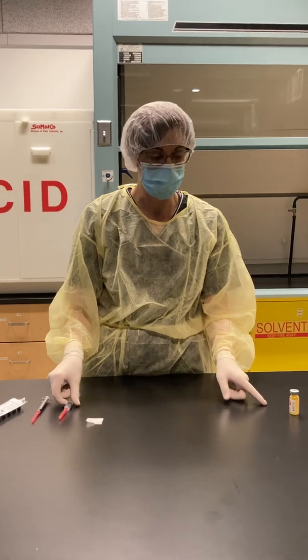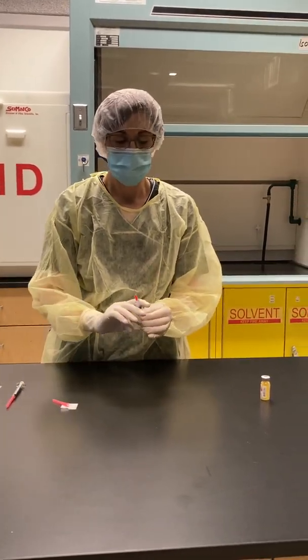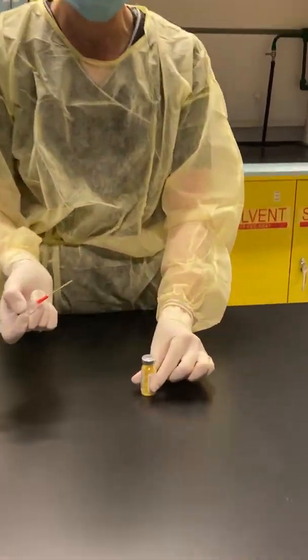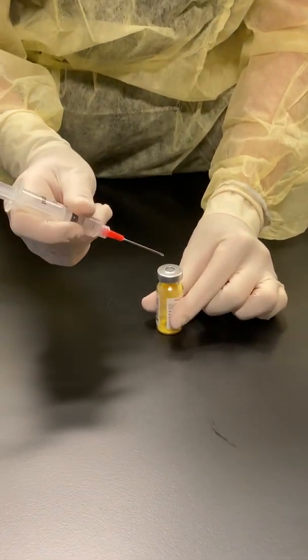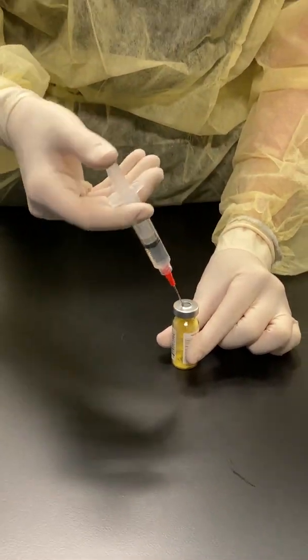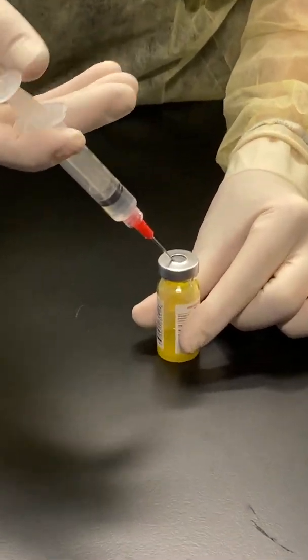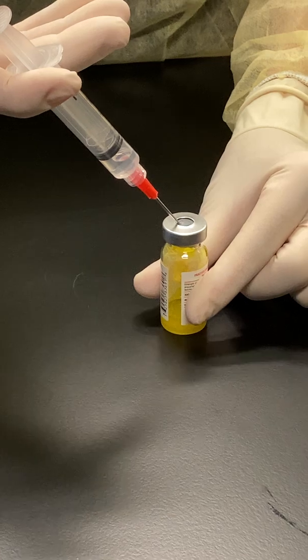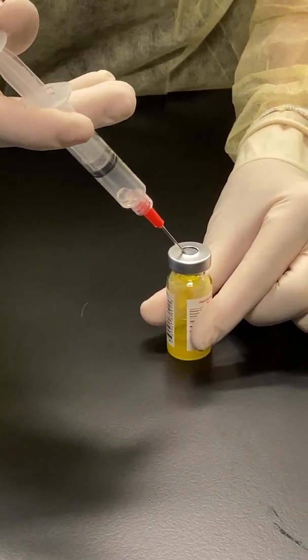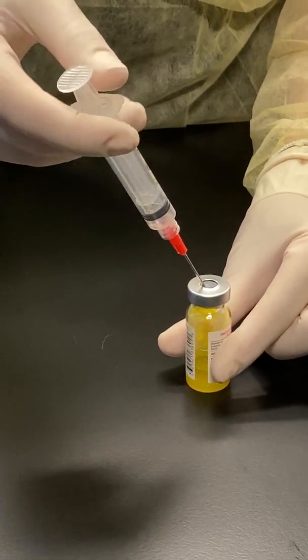Now that the alcohol has dried on my vial, I'm going to remove my needle cap, put my vial into my work area, and go in at a 45-degree angle just to puncture the vial, then straighten out to 90 degrees and milk. That means I'm going to put in a bit of fluid and draw out air into my syringe. This will prevent any spray from the vial.